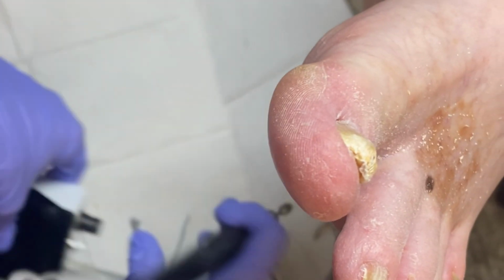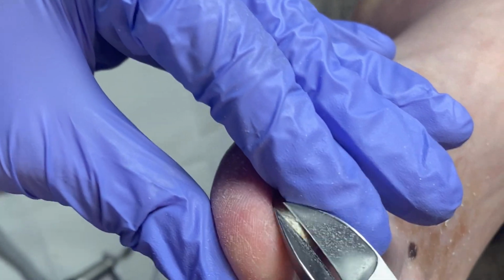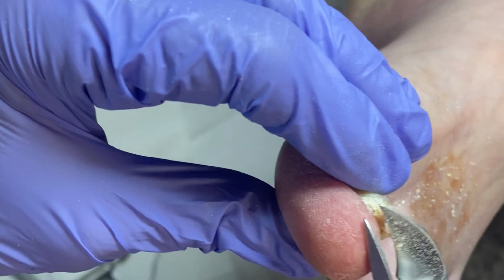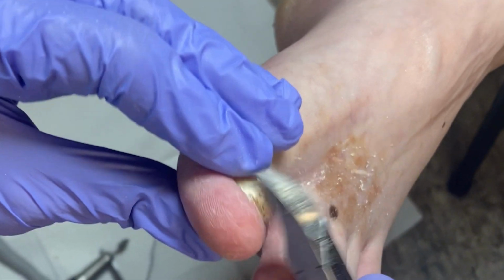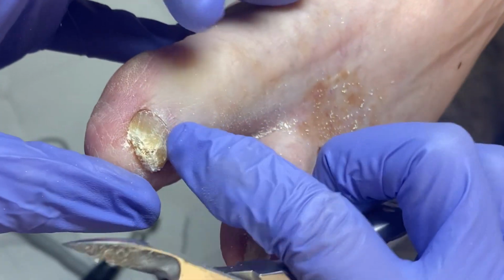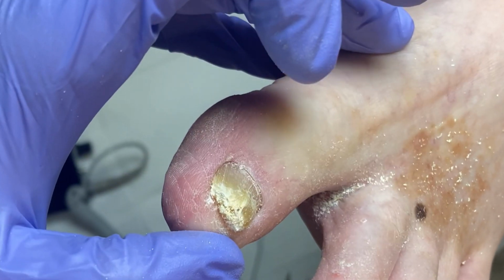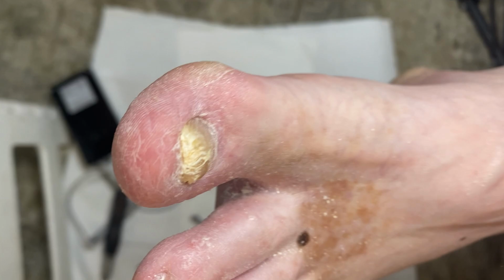The thing you don't want to do is go down the sides like this, because that will hurt the person and cause a wound. So just go little by little and it'll get it all down. And you don't ever want to push away the cuticle either, because that'll allow bacteria and fungus to get down in there. All right. Okay, and there it is.